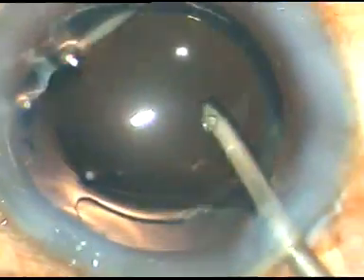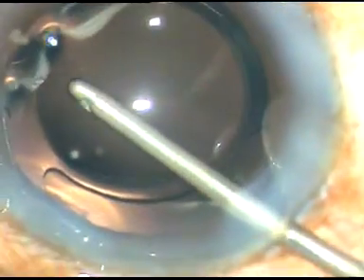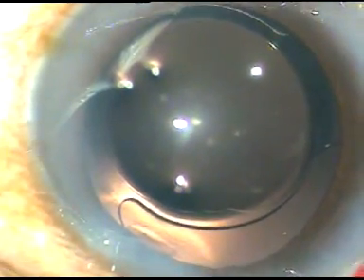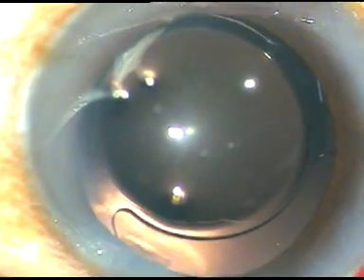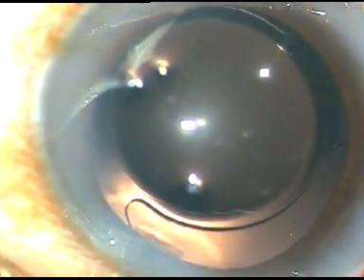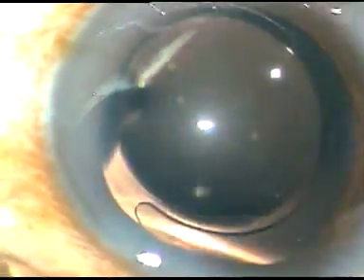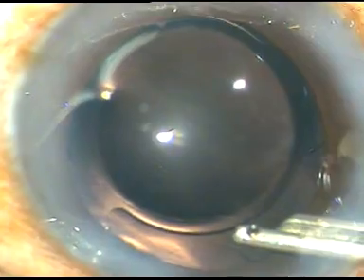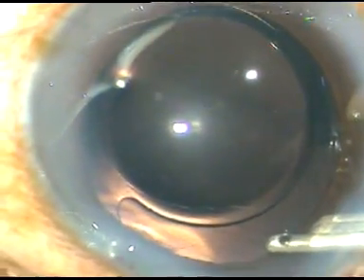In this case, I was not entirely happy with the placement of the lens, so I dialed it with the irrigating probe. The anterior chamber was reformed again and the case was concluded.